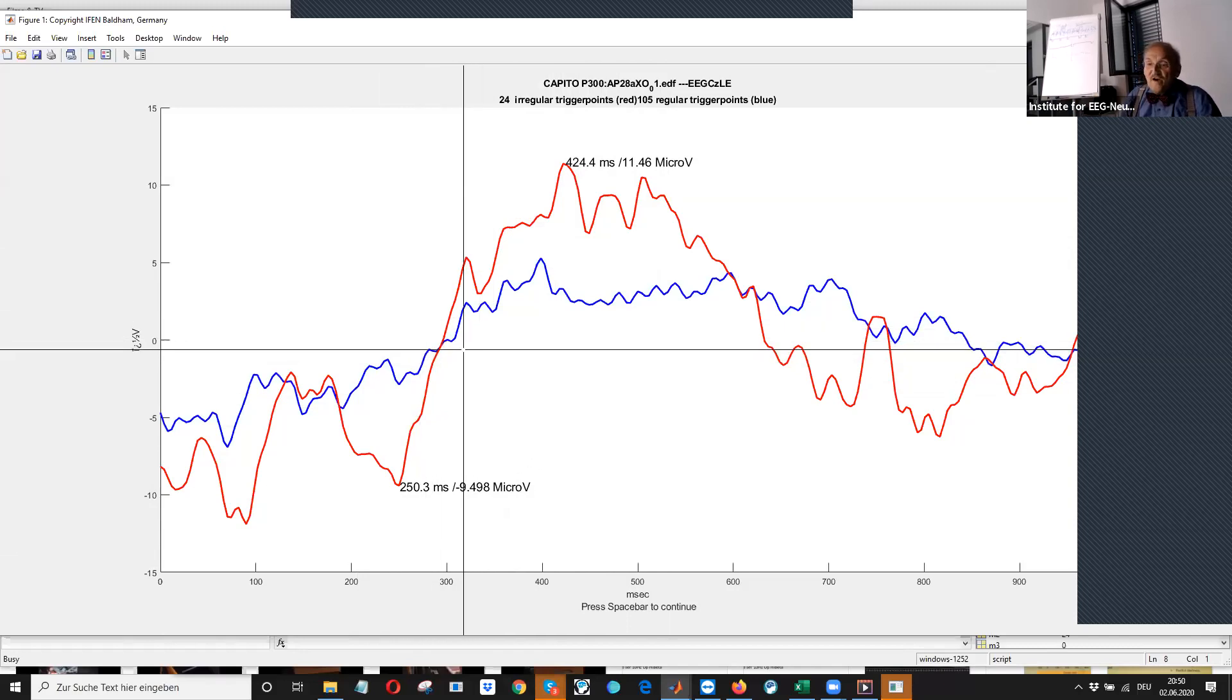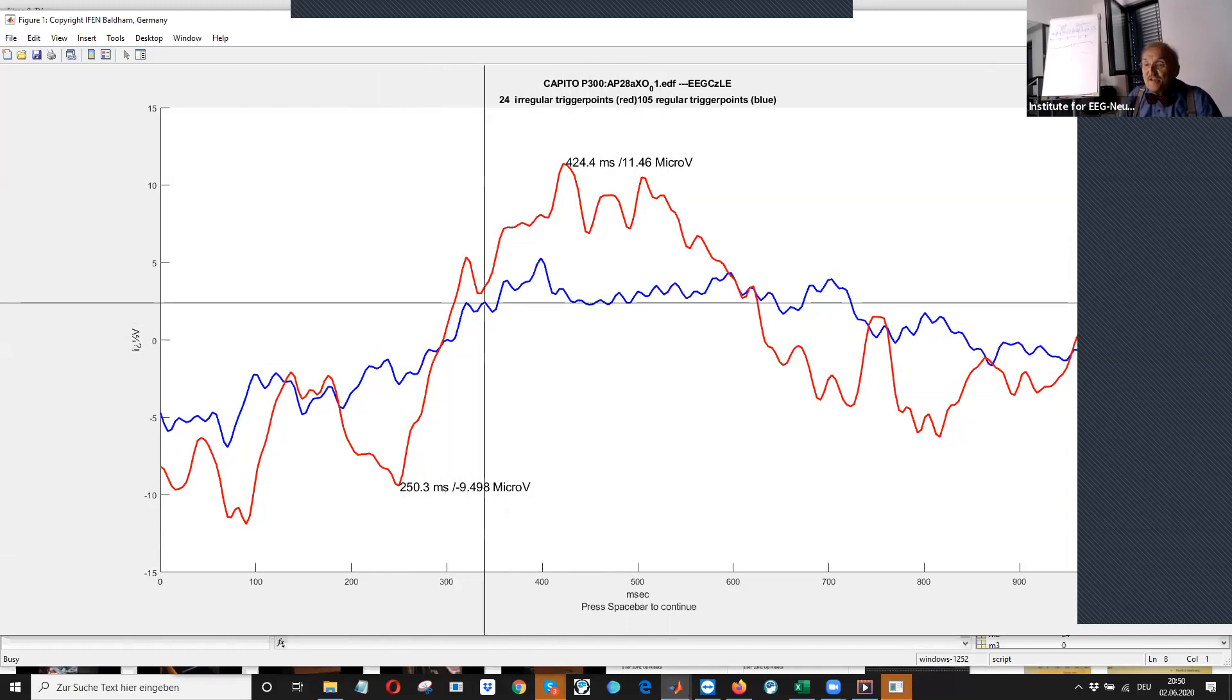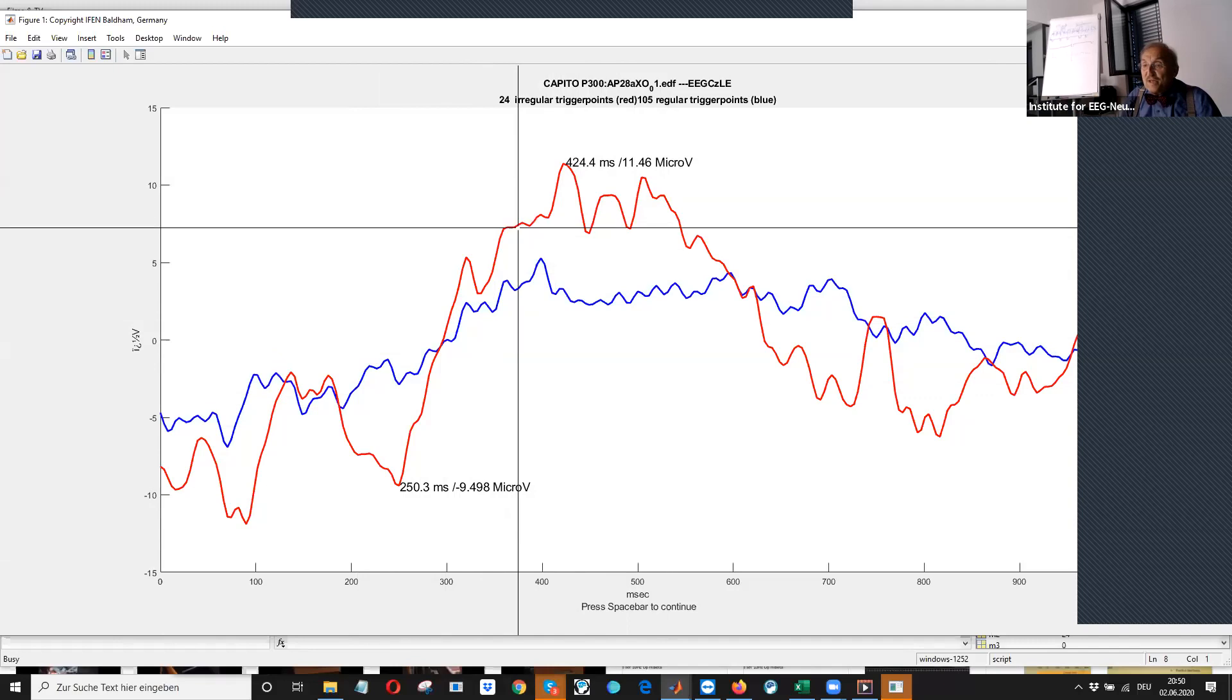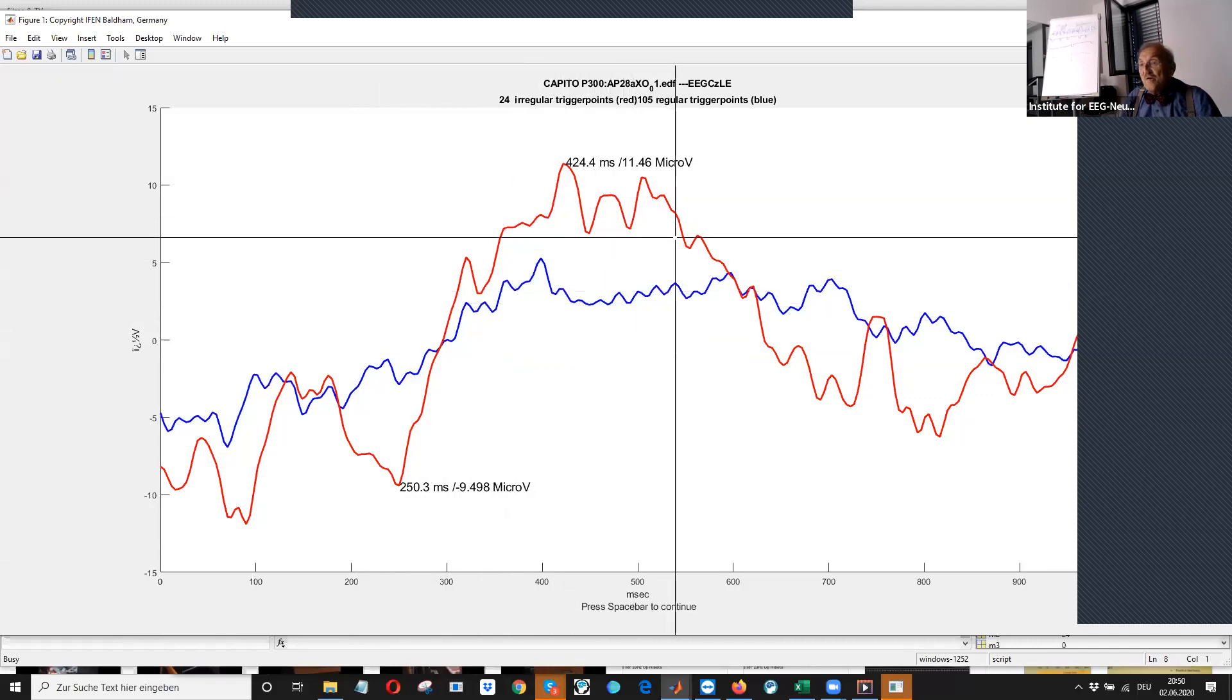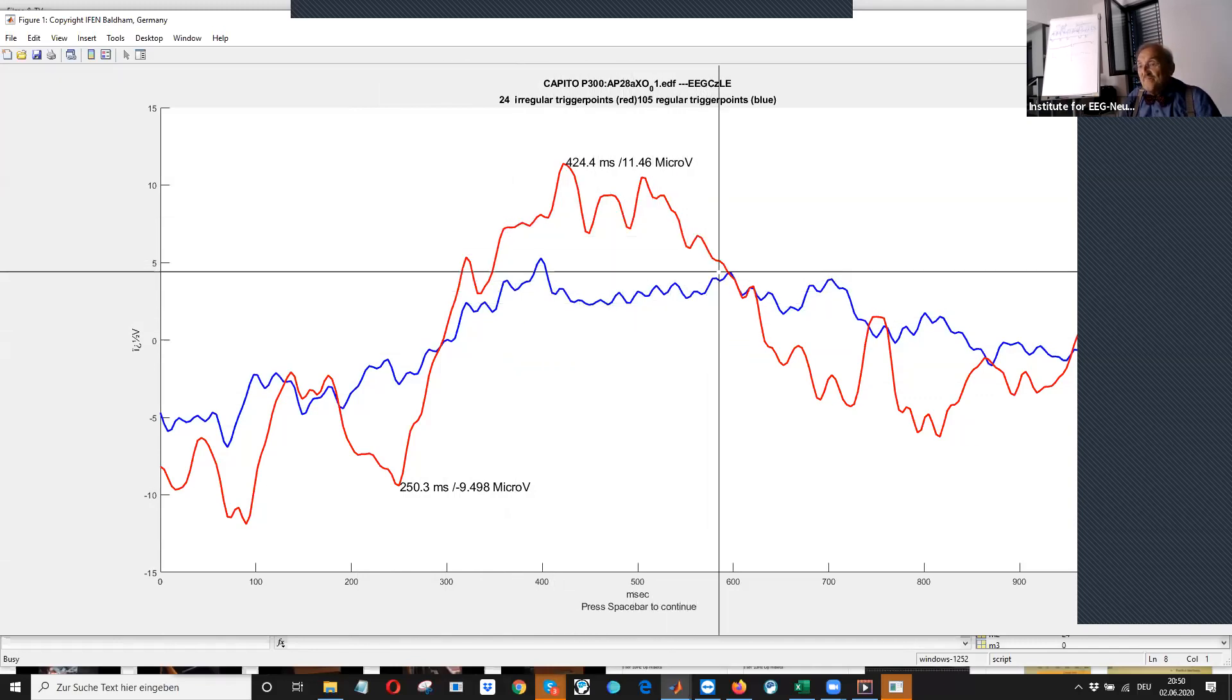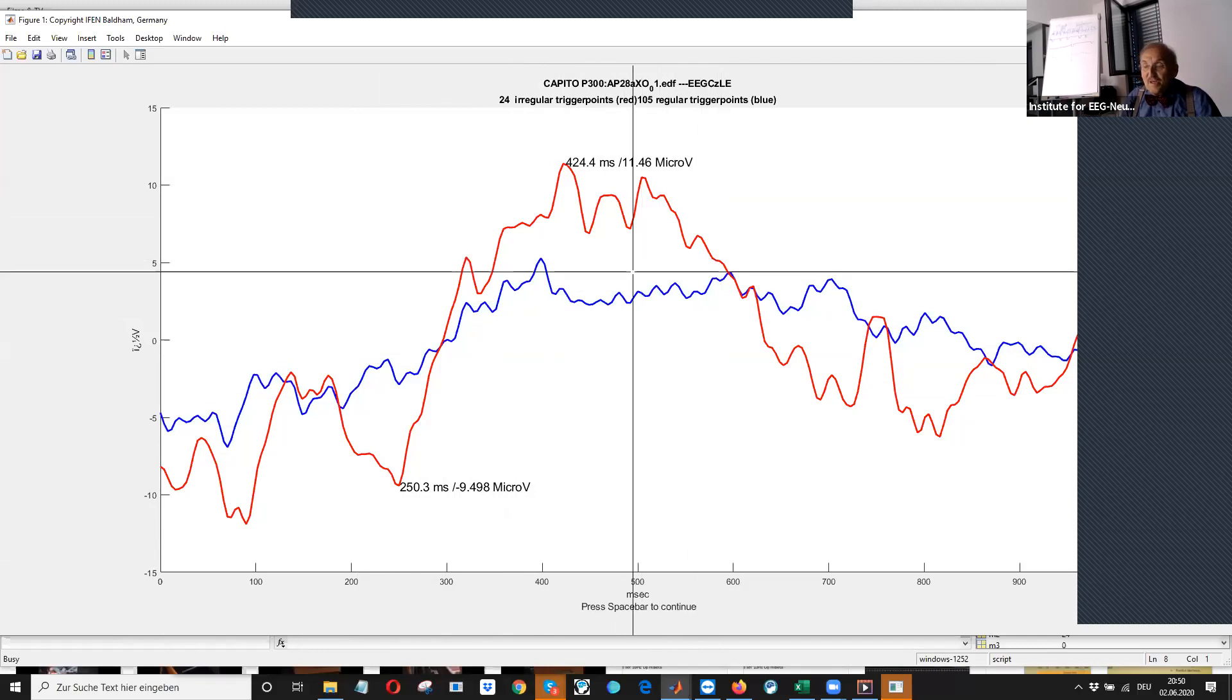If I'm interested in the difference here between the red and blue, then often the P300 can be seen better.